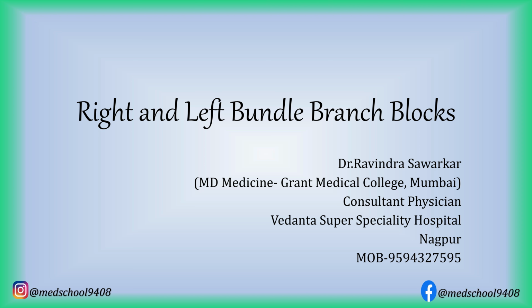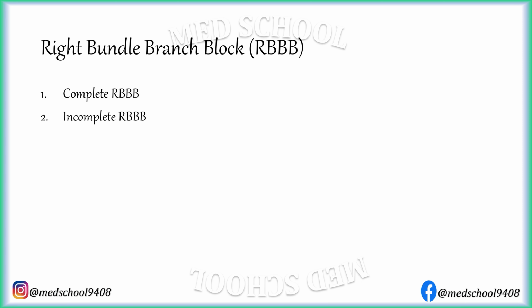Topic for this video is right and left bundle branch blocks. Right bundle branch block is further divided into complete right bundle branch block and incomplete right bundle branch block.